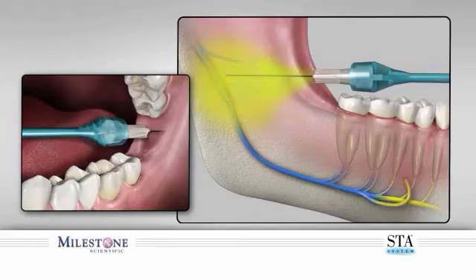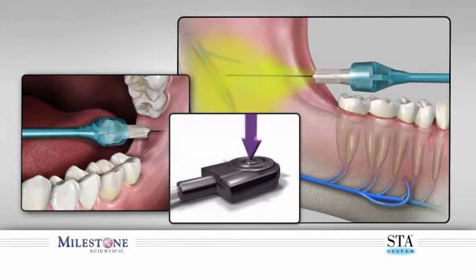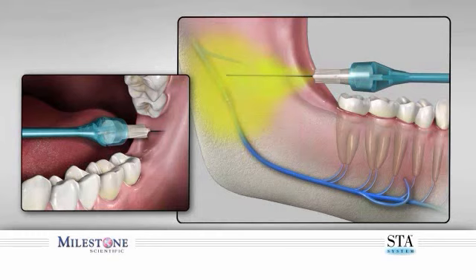It is recommended that the first quarter of the cartridge be dispensed using the controlled flow rate before you transition to the second, faster rapid flow rate. The rapid flow rate is used during block injections only after your patient has acknowledged that they have achieved soft tissue anesthesia of the area being injected. This is acknowledged by subjective statements obtained from your patient. When you have delivered the required dosage, you can remove the needle.